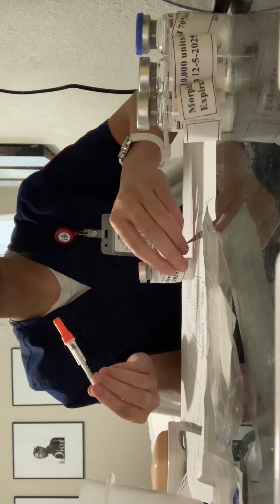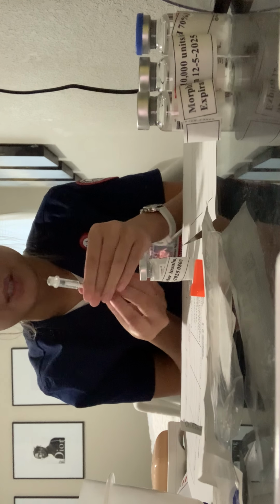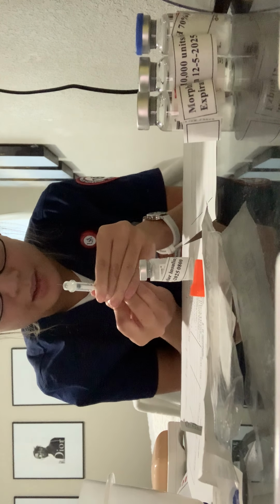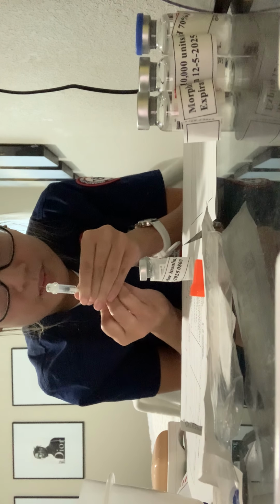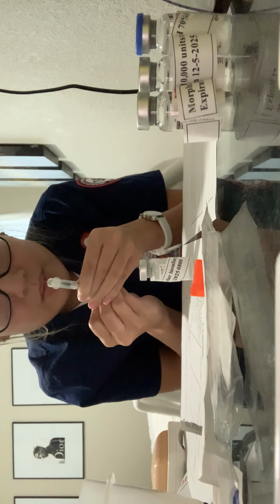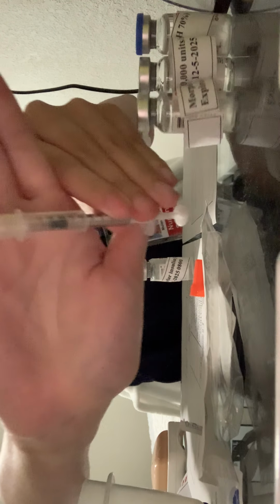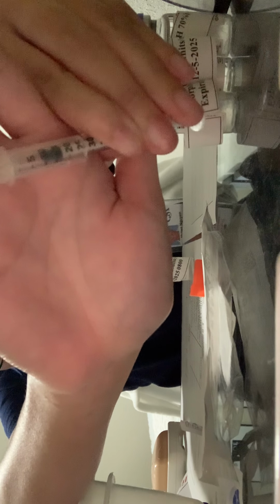So take the cap off. Now I'm going to draw out 10 units of air. Okay. So I have my 10 units right there.